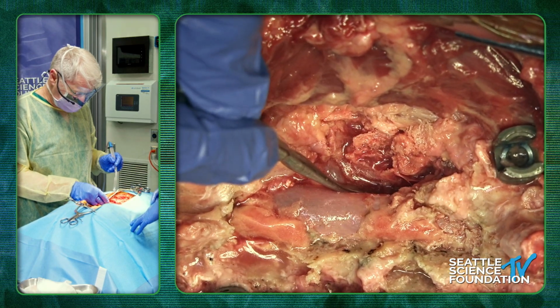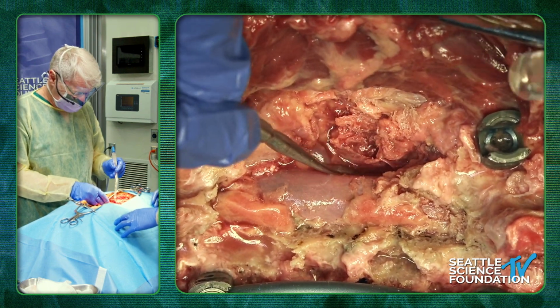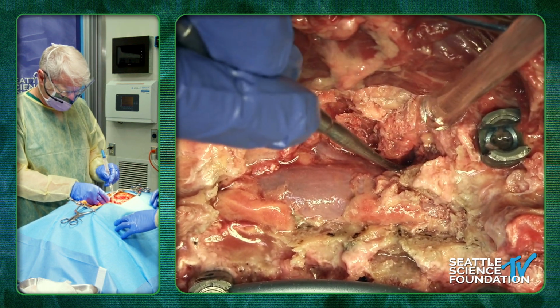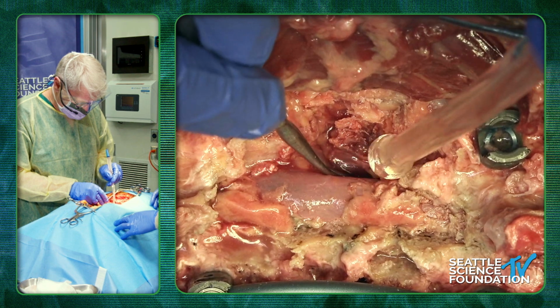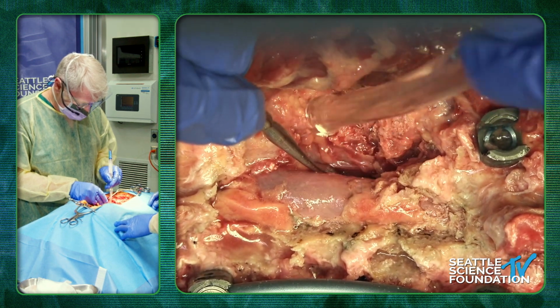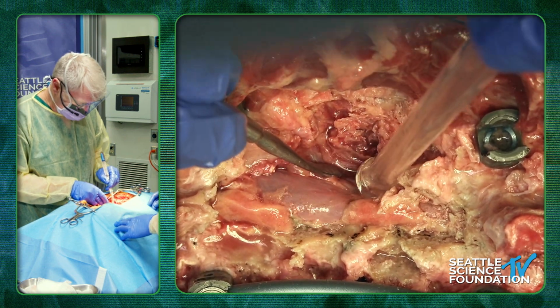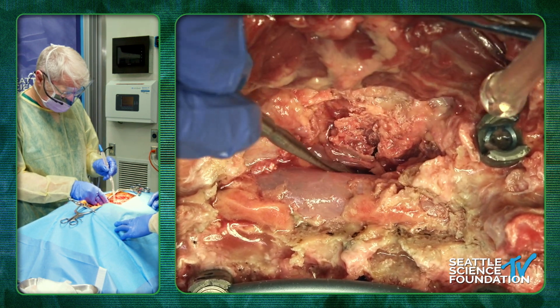Yeah. And so now's the time to take out your bipolar instead of your osteotome and work hard on this vein here. I usually follow it all the way up. It goes up above the pedicle, medial to the pedicle, and then just underneath the nerve root. And this is really what controls your bleeding. You can see they're really nice big veins, and they're in the way, and they have to go. So spend your time now isolating these out.